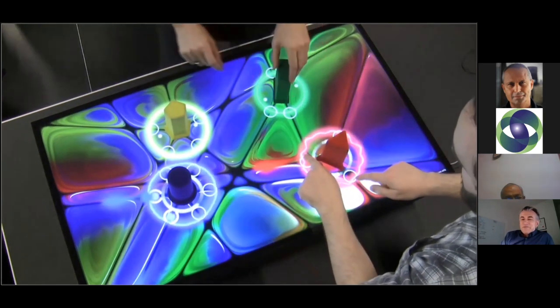So what we found with this is that even with the slightest movement of these interfaces, you can actually create some fairly complex compositions with minimal effort. In many cases, our participants will struggle to move these objects, so we're really wanting to encourage and engage them with this. And again, in a group activity, they can see others interacting with it, and they might want to try something out for themselves, and we want to see how they play with it.